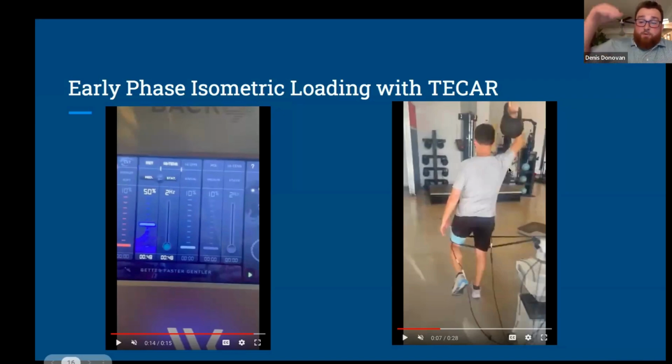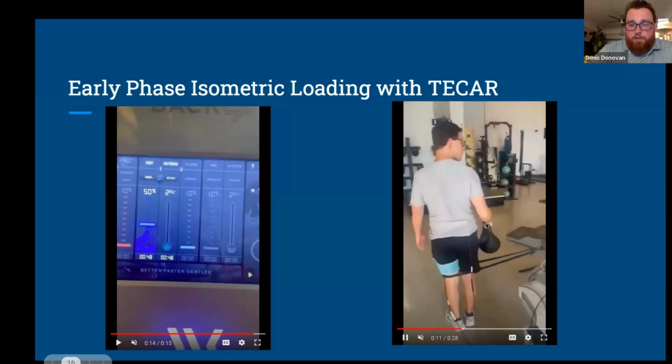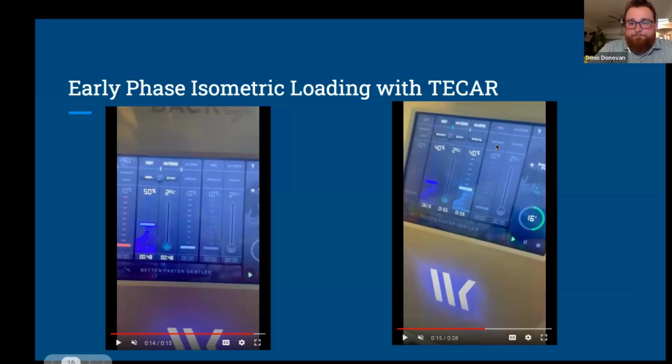So going back to what we were talking about, as far as the stable and mobile segments, right? We're getting a really good contraction here in the scapulothoracic joint, getting some stabilization there, while he is also engaging the gluteal muscles on the other side. So really the goal of this is core control, and he's a little tilted for where I like, but you see here, I have the high EMS going. Again, looking to increase contractility.